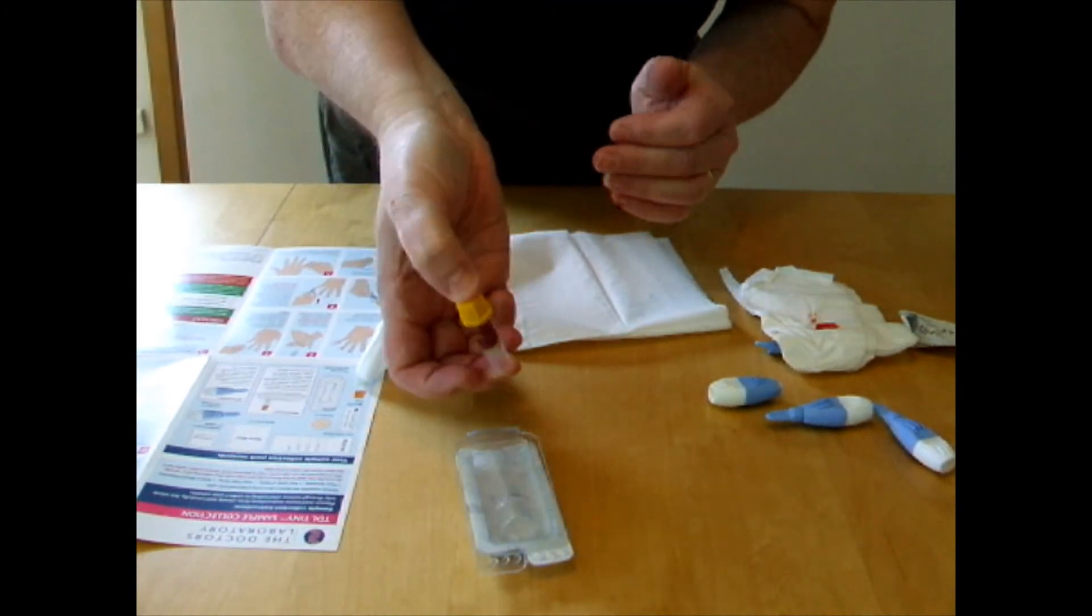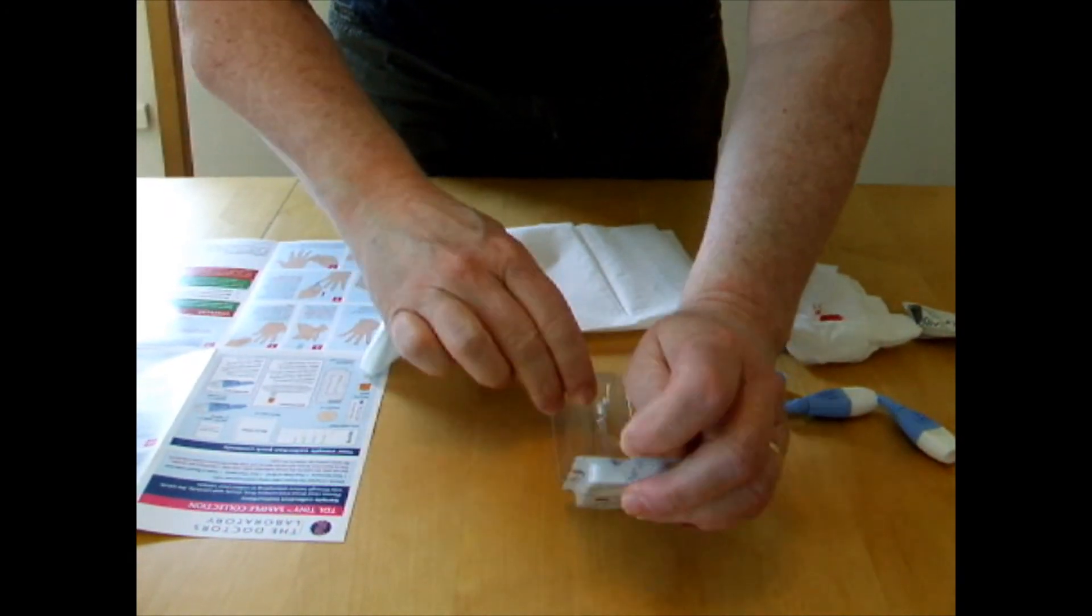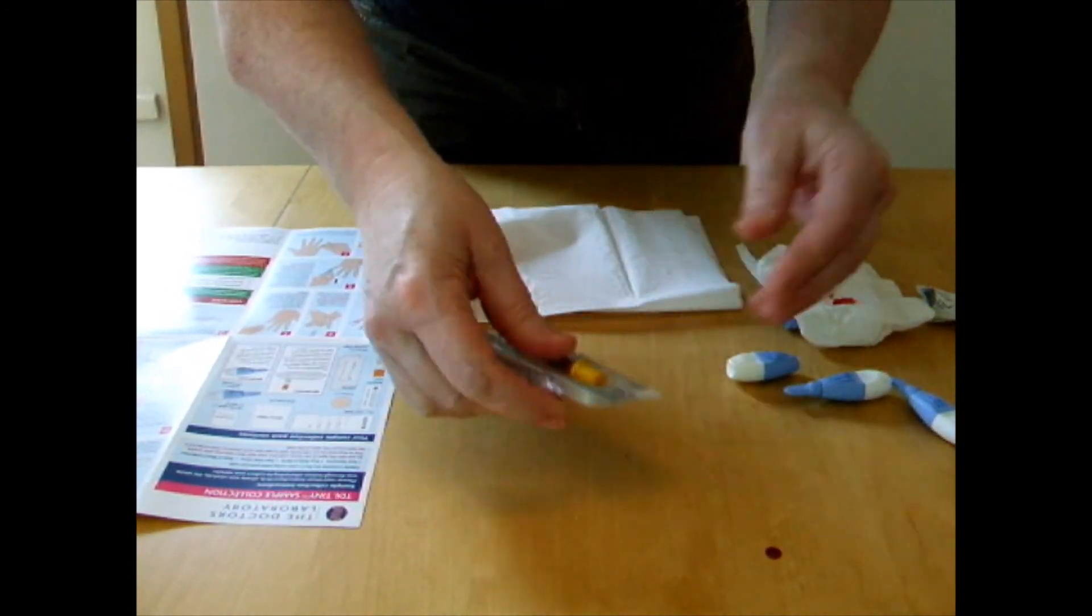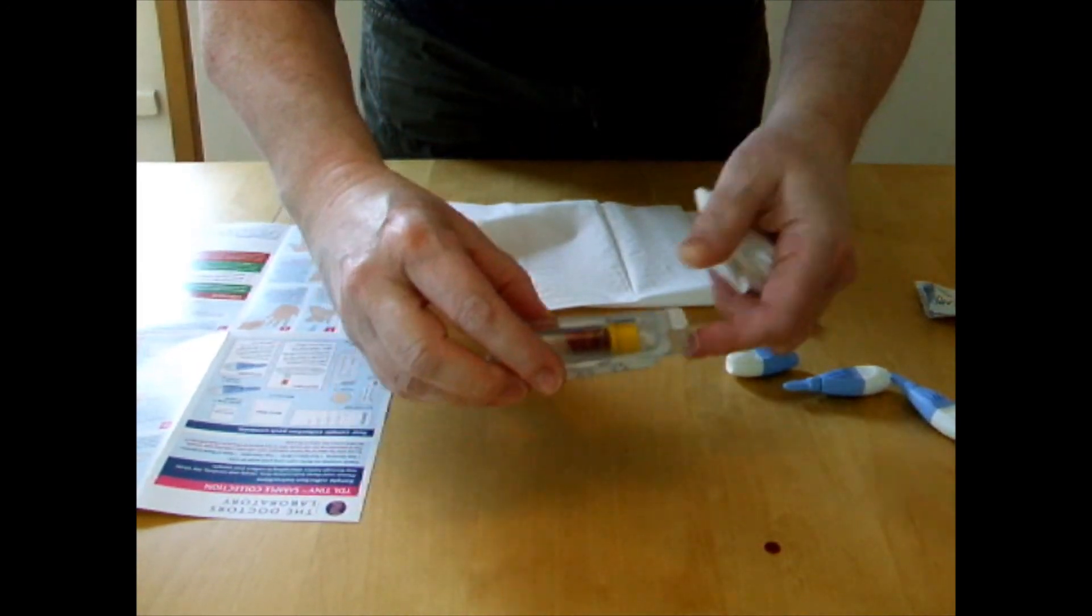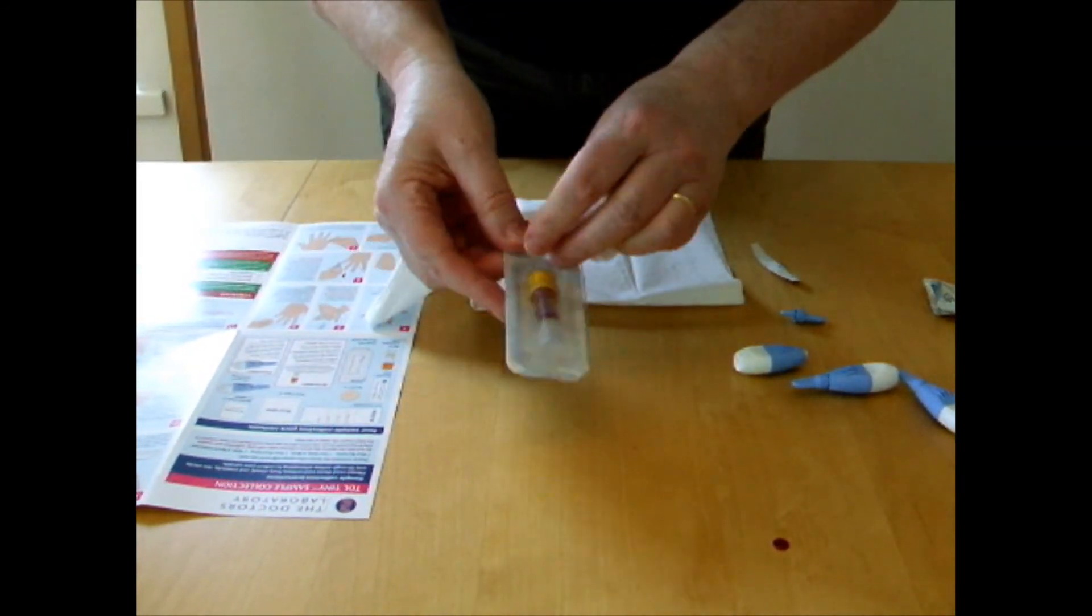It's quite important to do that and you put it into the container and the container then goes into the box.